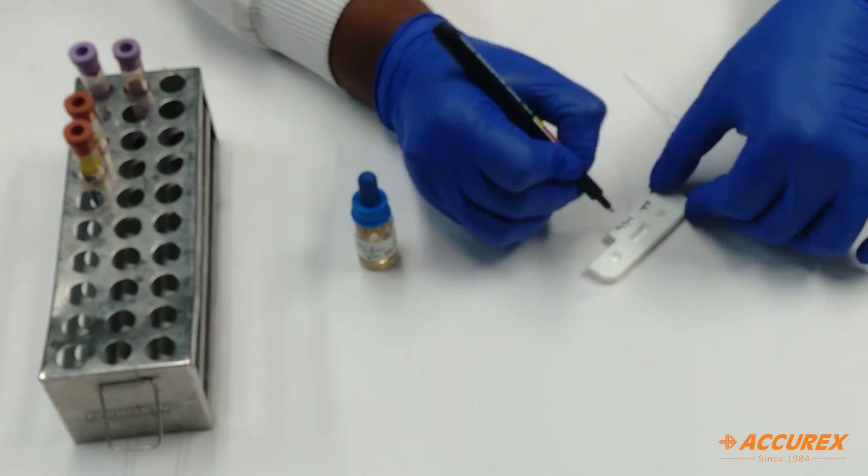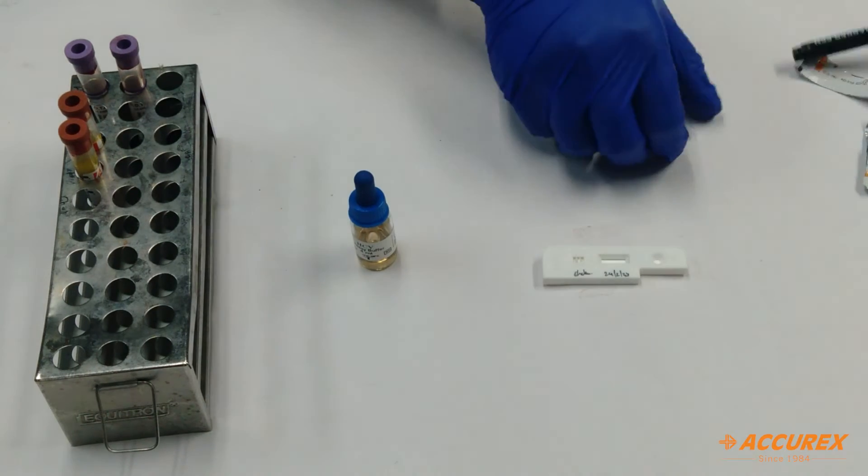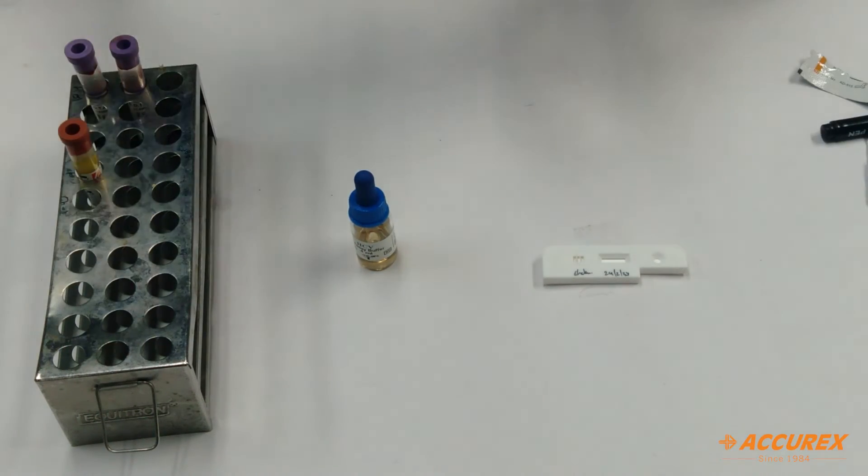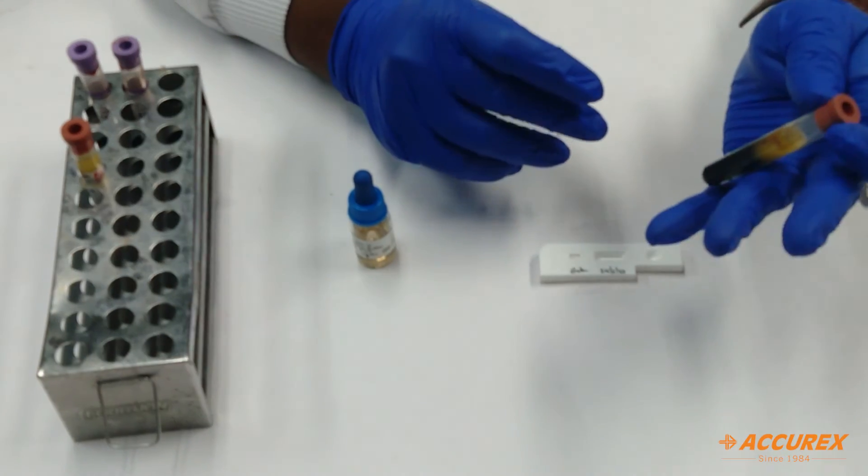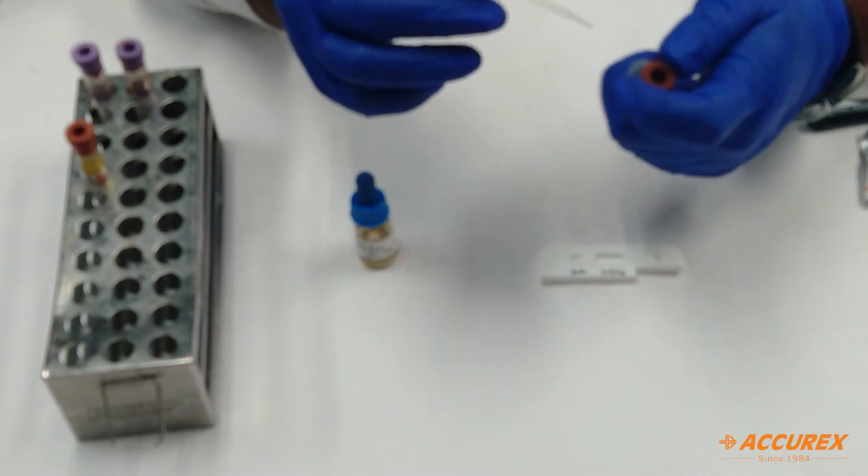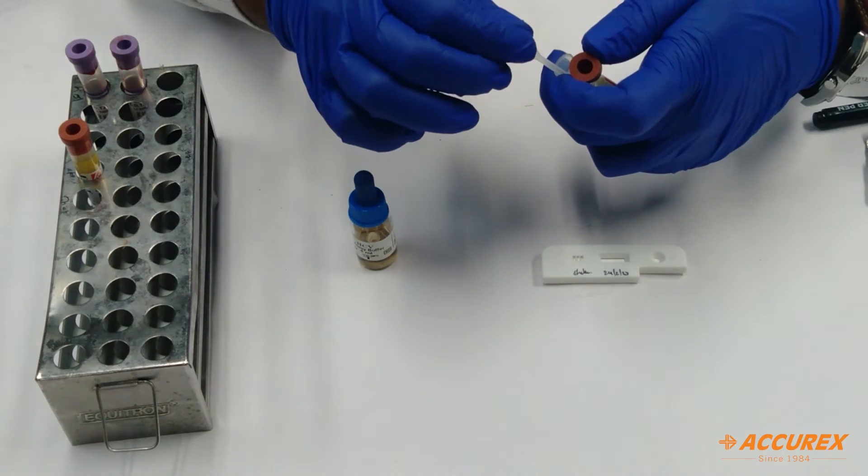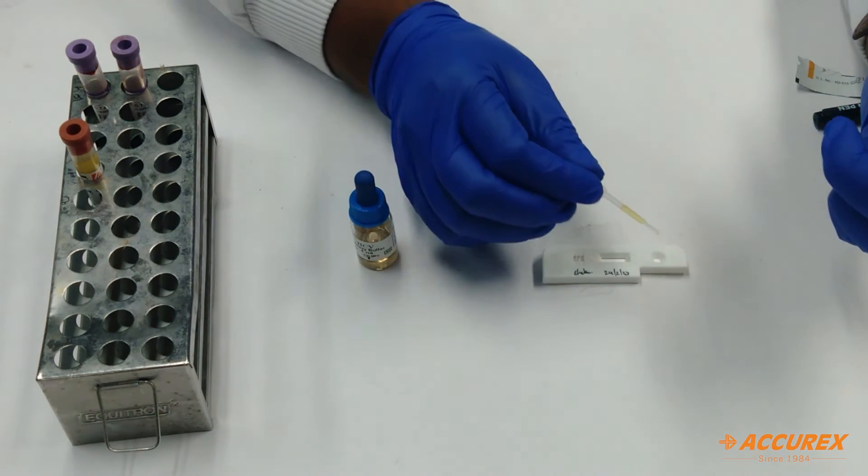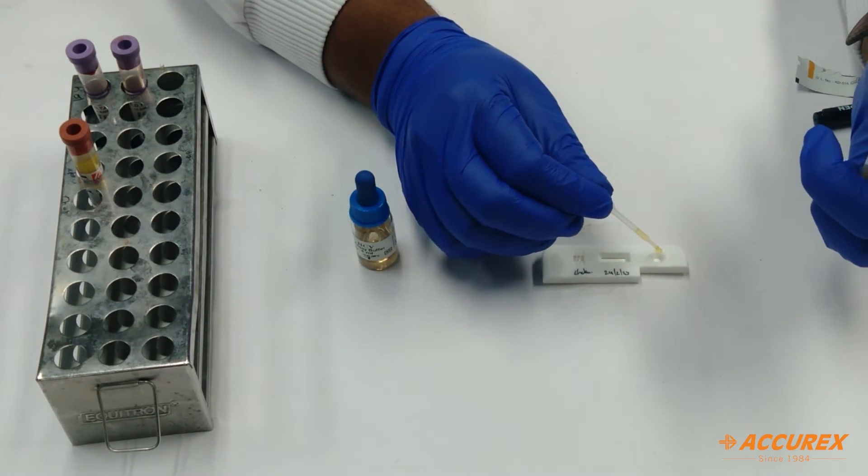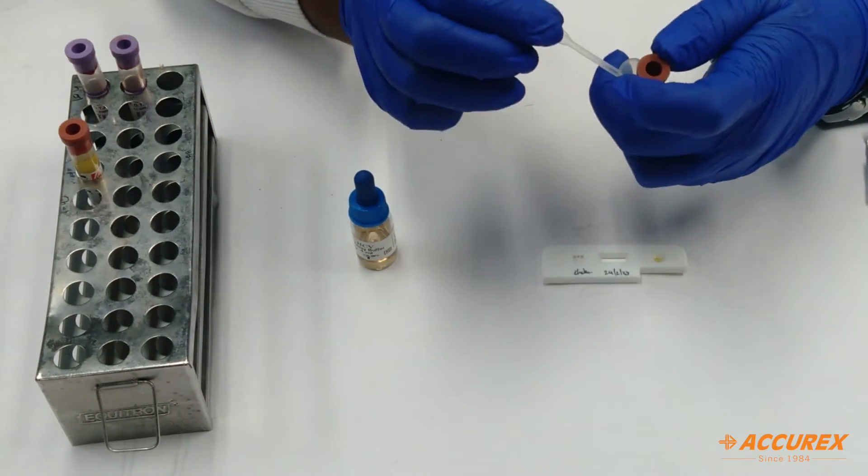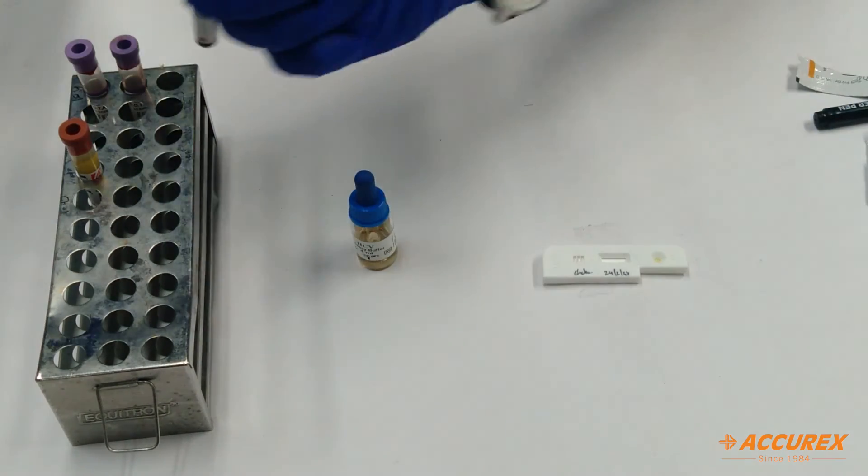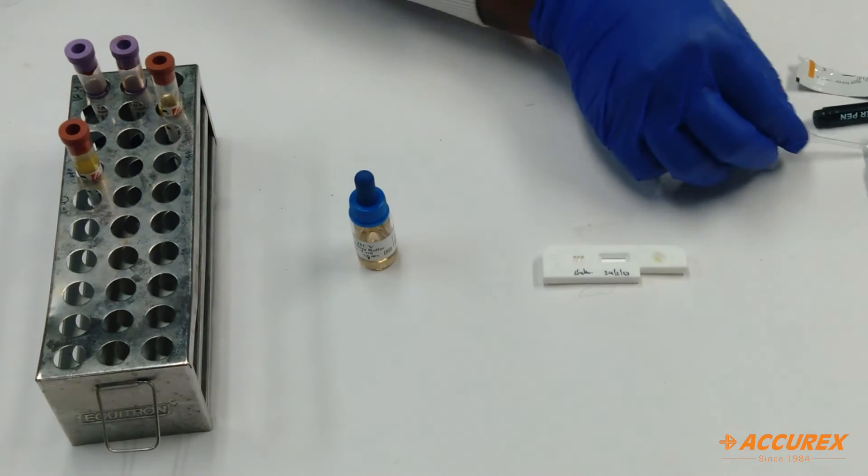And the date. For the sample, you need to take serum sample, one drop. I've already collected the serum sample in a plain tube. You need to add one drop of serum sample in the sample well.